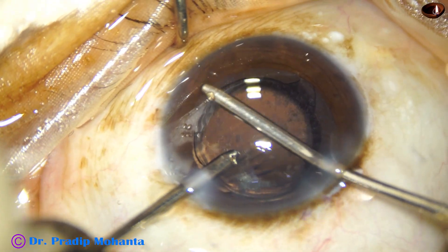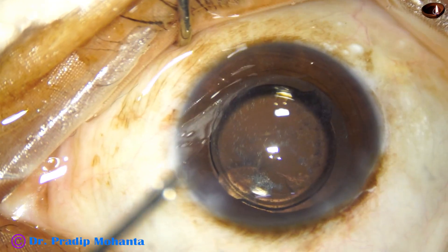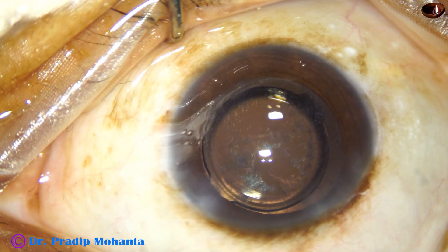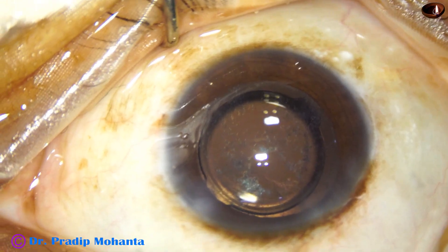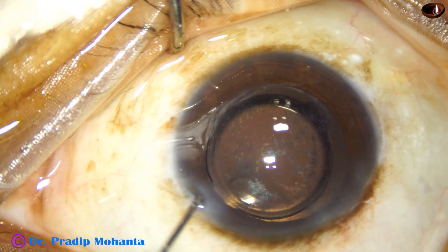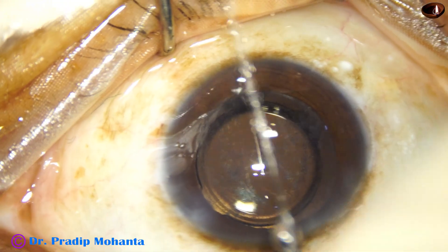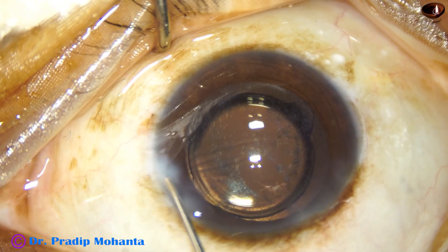Again, I am using bimanual irrigation-aspiration, cleaning the Visco nicely, sweeping around so that the Visco that is in the angle gets displaced and comes out. All the Visco has been irrigated and aspirated out, and now we are ready to conclude the case.